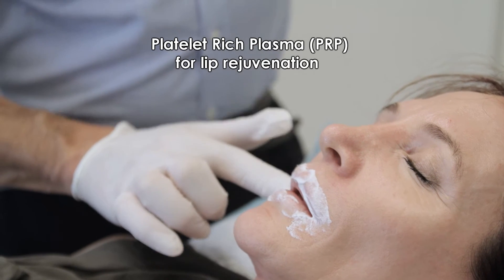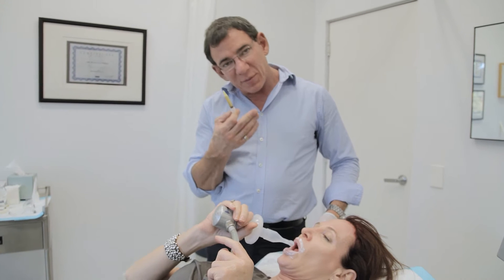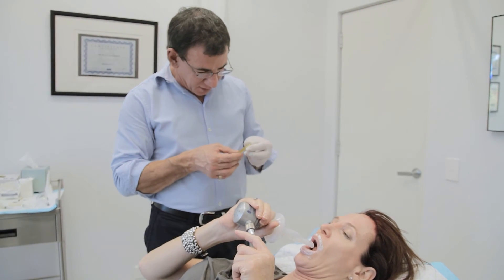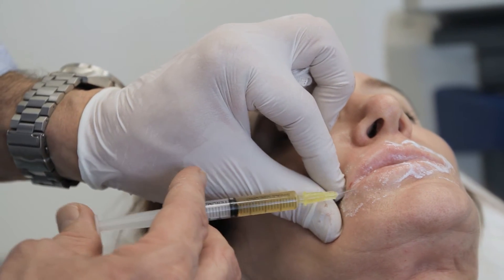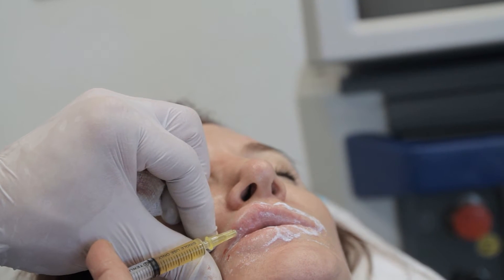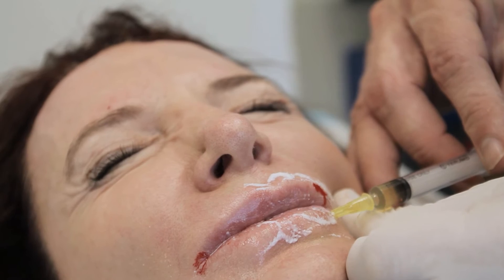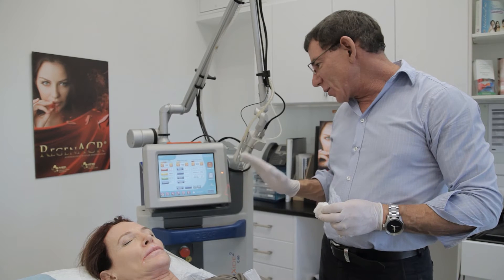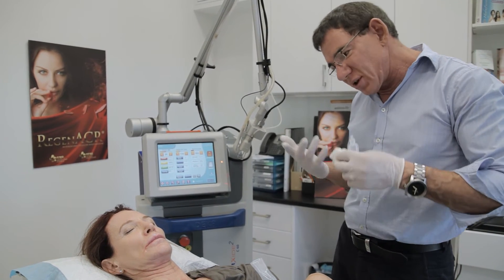Now we're going to do some lip rejuvenation. First we put anesthetic cream on the lips, and now I'm going to inject platelet-rich plasma into the lips, then use the remaining PRP as a wound dressing on the outside. I'm going to put this in like I would do a lip filler. This is called the vermilion border — the border of the lip — and I'm injecting PRP into the border to try to give a crisper lip line and a little bit into the body of the lips. Then we're going to use the fractionated CO2 laser to do a minor resurfacing procedure of the outside of the lip, which will help to improve the colour, rebuild the lip line, and generally make the lips look more youthful.